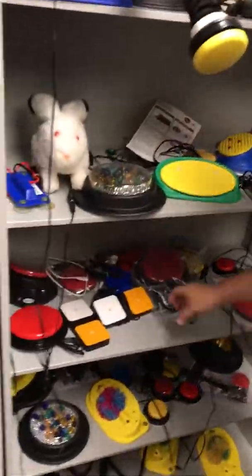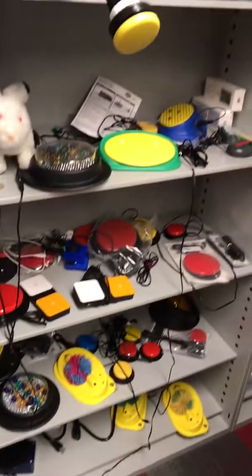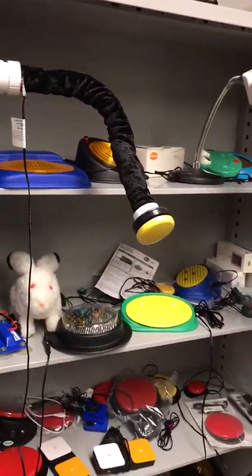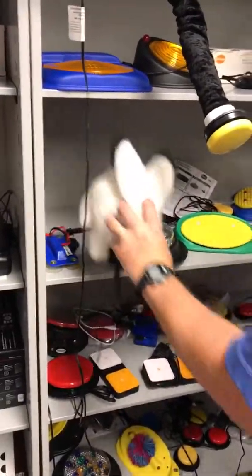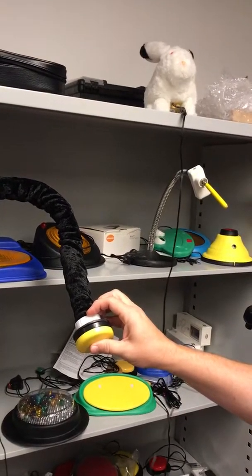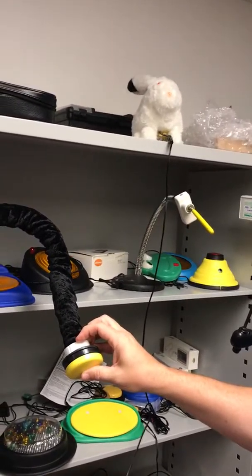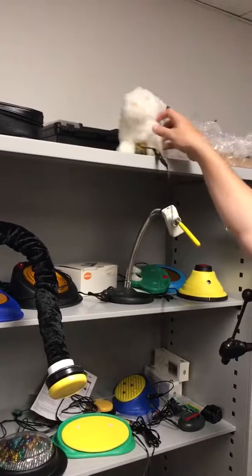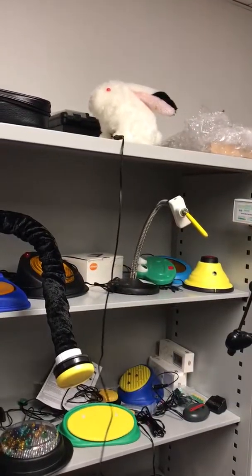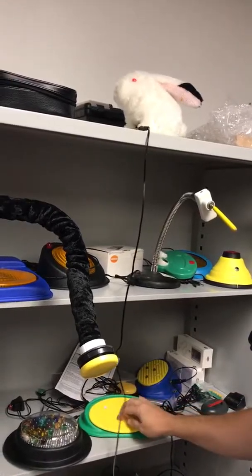Switches are things that basically you would hook up to a device. I don't have my bunny. Here's my bunny. That's a switch. So these are all different kinds of switches. This particular animal is set up to run. You have to be able to hit a switch to be able to work it, and a switch can be almost anything. Mostly it's just a button that you push.